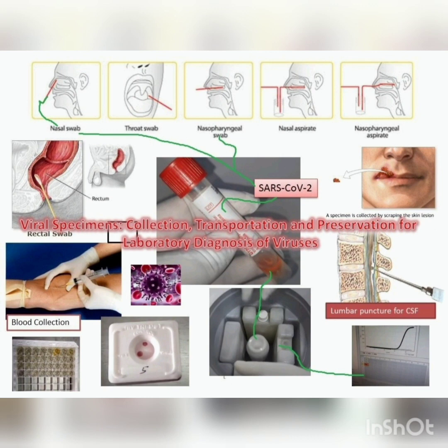And then there is collection of specimens for anaerobic culture. They will use a double stoppered collection tube because oxygen may enter. That's why a double stoppered collection tube, a special test tube, needs to be used, with oxygen-free carbon dioxide and nitrogen recommended. So a double stoppered collection tube with oxygen-free carbon dioxide and nitrogen is needed for anaerobic culture.